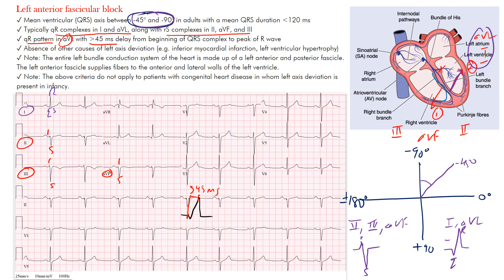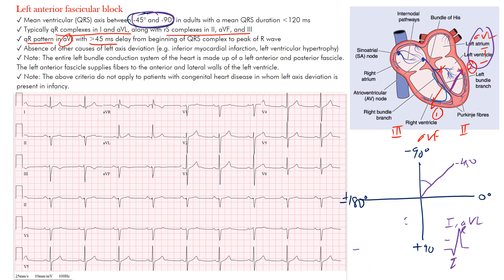Now let's look at the axis. We won't go over how to find it in full detail — you can go back and listen to those other lectures — but let's take a look at what the axis is here. We're looking for that leftward axis in the range of between negative 45 and negative 90 degrees.